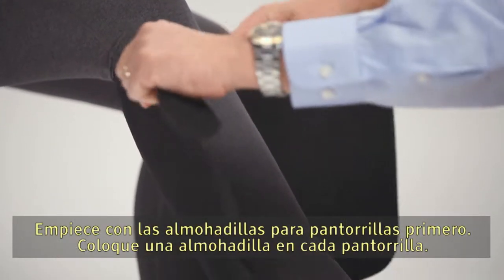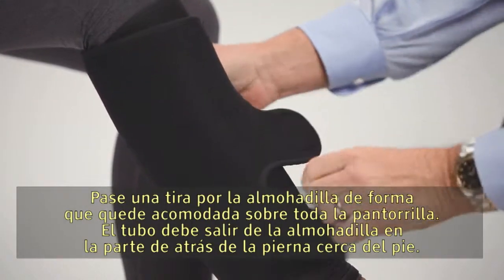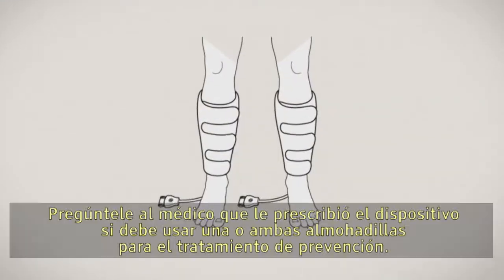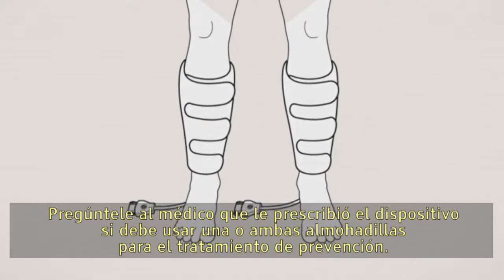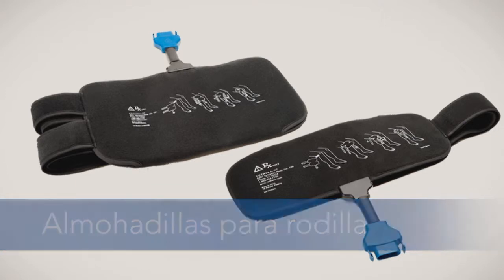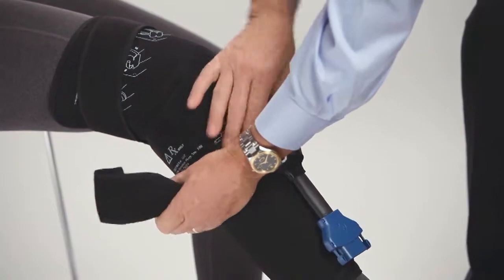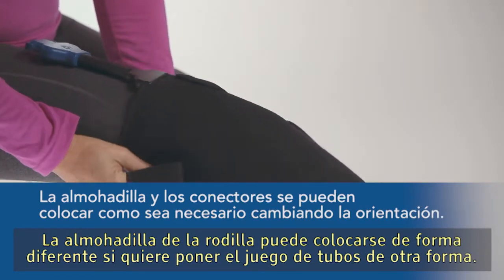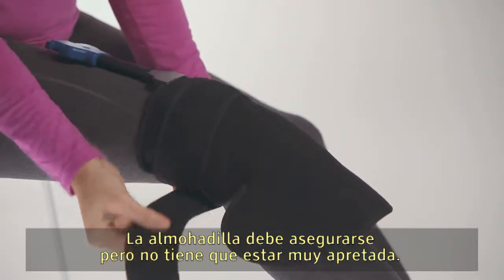Start with the calf pads first. Place a pad on each calf and strap the pad so it fits snugly over the whole calf. The tubing should exit the pad at the back of the leg, near the foot. Ask your prescribing physician whether you should use one or both pads for prevention treatment. Strap the knee pad so it is centered and fits snugly over the knee. The pad should be secure but does not have to be overly tightened.